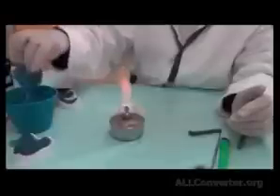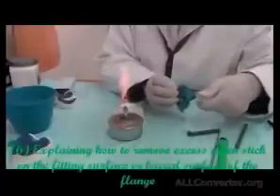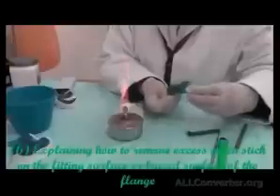Put it in warm water. It's no longer sticky to my gloves. This is why I'm cooling it with the warm water. I'm gathering the material. Anything on the fitting surface, once more, I'm pushing it to the out. Anything on the buccal surface, I'm squeezing it on the border. Anything that is not attached or not sticky, I just remove it.